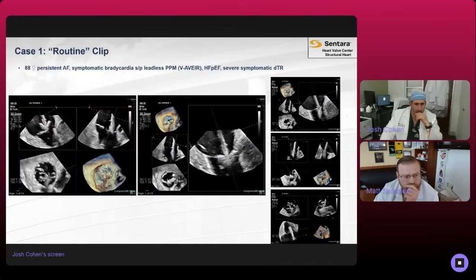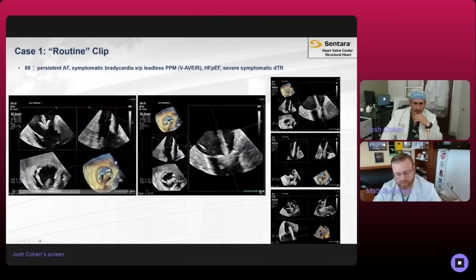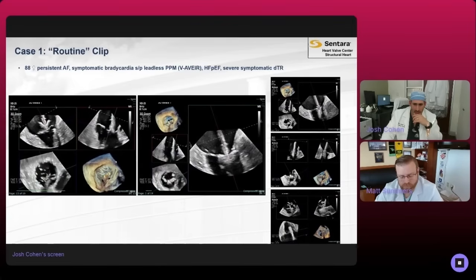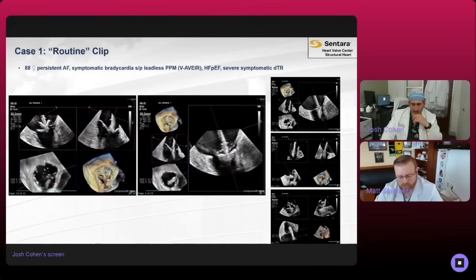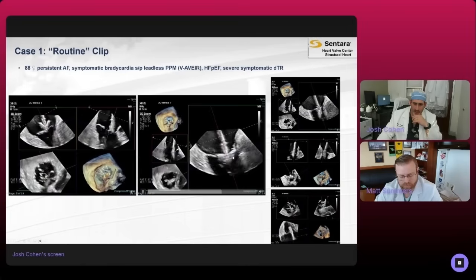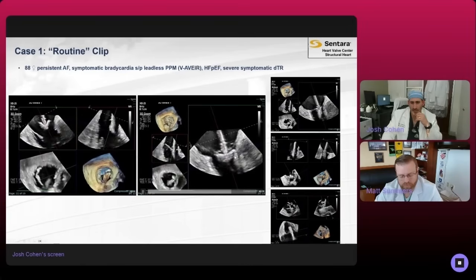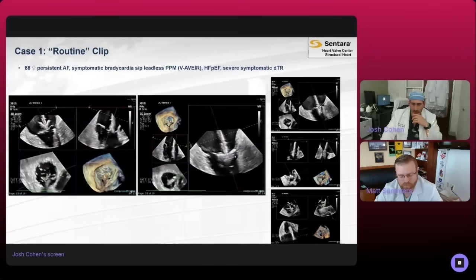And so we start here. We're above the valve, towards the anterior part of the valve, to orient you. Aortic valve here, septal, anterior, posterior, or we'll say septal and lateral because we think it's a two leaflet valve. We go under the valve. We see the leaflets inside the clip. What you're looking for is the base of the clip before you let those down. As I showed you, I'm aligned reasonably well with that clip, so I see the arms perfectly well, and where the leaflets are interacting with those arms. We come down and see both leaflets in the clip.